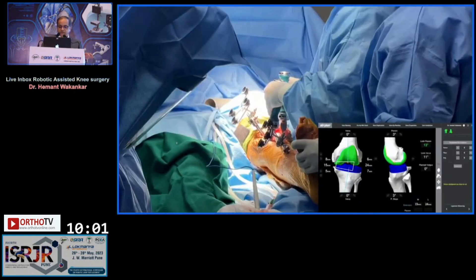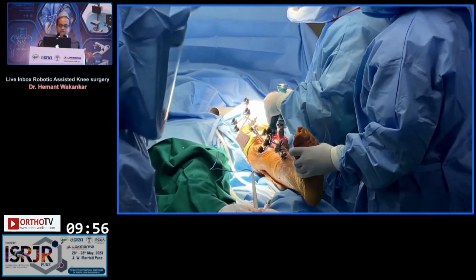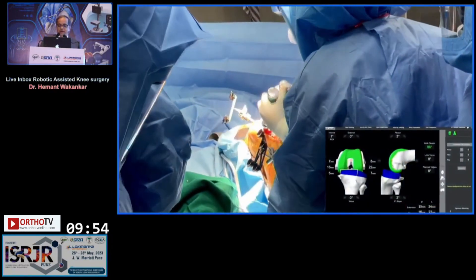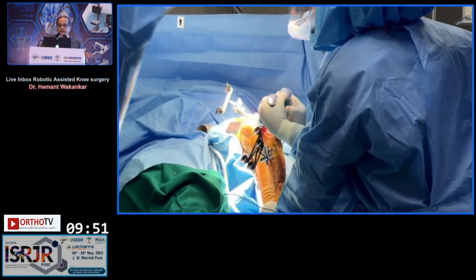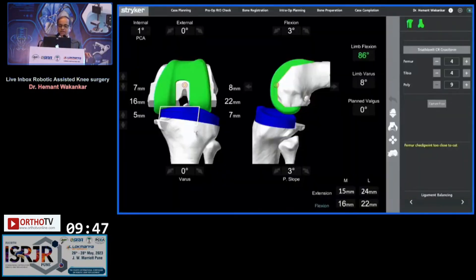I put curved osteotomes both medially and laterally, stretched the collaterals, and registered what the medial and lateral gaps look like. This is done in flexion and extension, and this is the kind of screen that we get. The bottom right side is what you should be concentrating on. You can see on the lateral side in extension that's 24 millimeters, and in flexion it is 22 millimeters — meaning it is significantly lax on the lateral side. My aim is 18 millimeters.